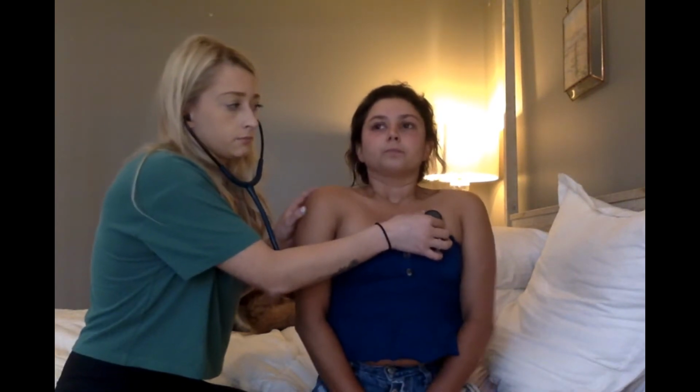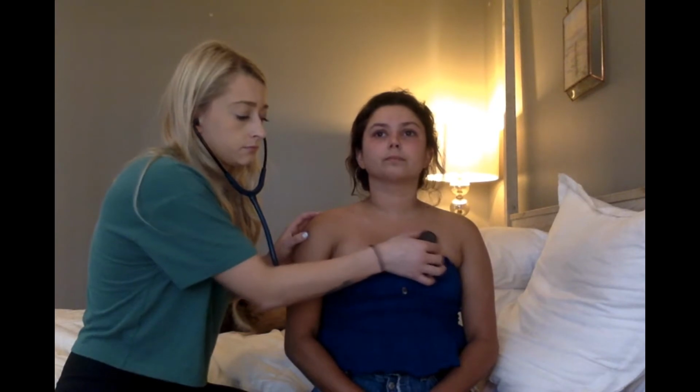Now we'll do a respiratory assessment. Are you breathing okay right now? Yeah? Okay. So we'll auscultate your lungs. Listen for any wheezes or crackles. So normally, with a patient, I would go usually under the gown and wouldn't auscultate over any clothing.